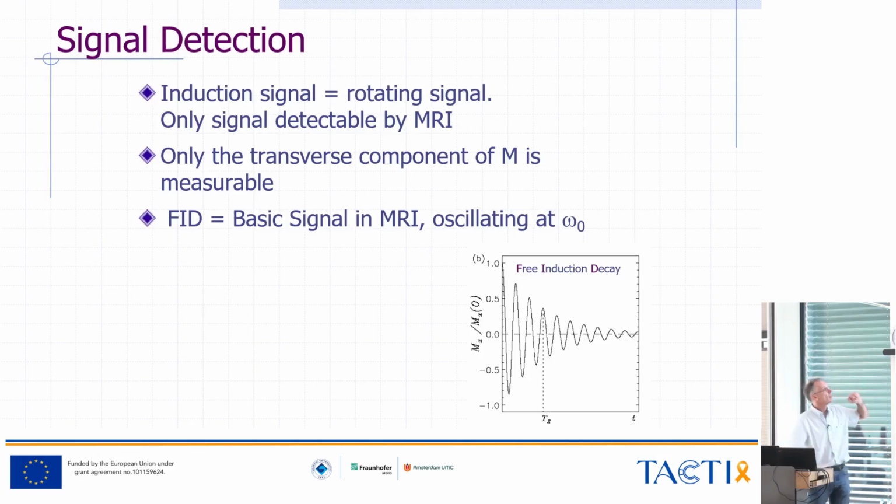So that's just what we actually looked at. We are flipping our magnetization down and then looking at the signal, what's happening. That's called a free induction decay. So we are not doing anything.